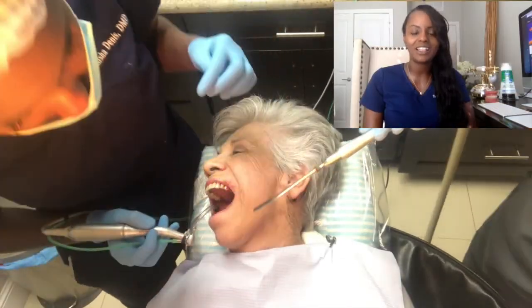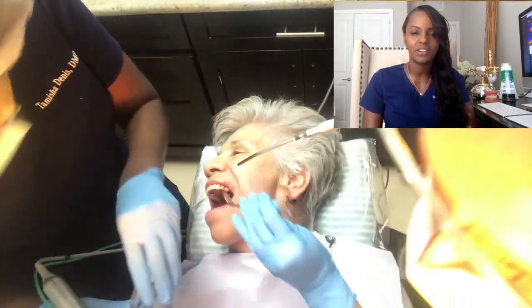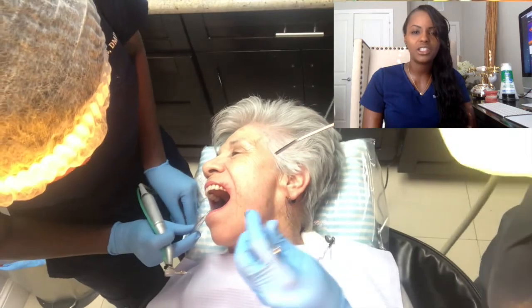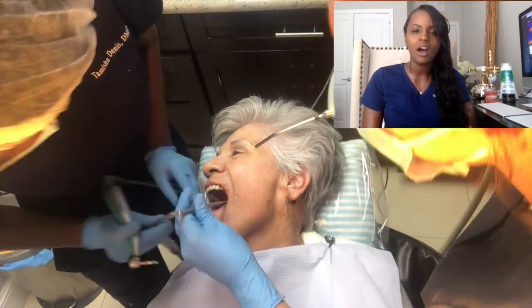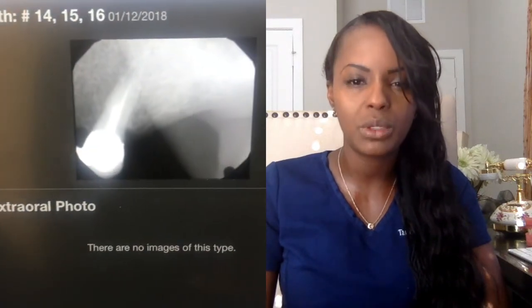I didn't get the chance to start from the very beginning with the injection and everything like that. But this patient had a tooth missing on the upper left that she had extracted, I would say anywhere between 2 or 3 months ago. She takes really good care of her mouth. It was just unfortunate. I think the tooth had a root canal previously and it broke and another dentist extracted it. And so what we did is we were going to add one implant to the back of the area where the tooth was extracted.